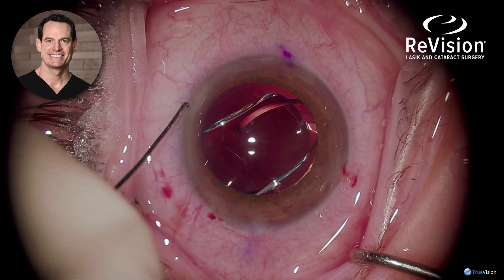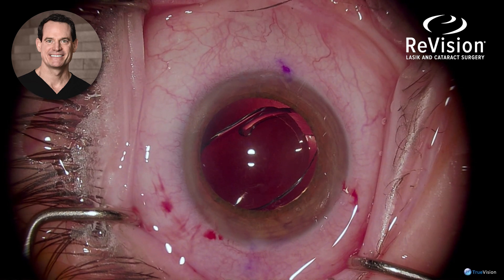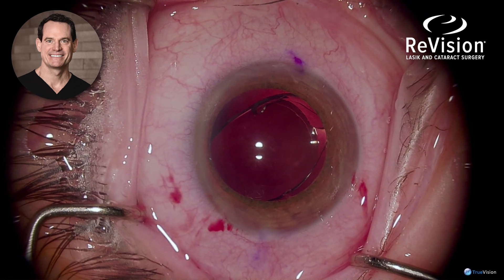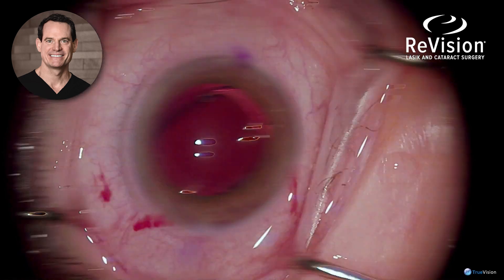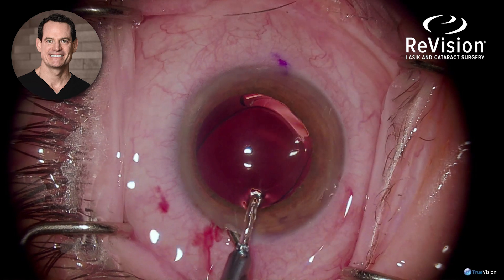Then the LRI, or Limbal Relaxing Incision, that was made by the laser is opened, because a lot of times the epithelium covers the incision site. That needs to be breached for the full effect of the LRI and astigmatism control.